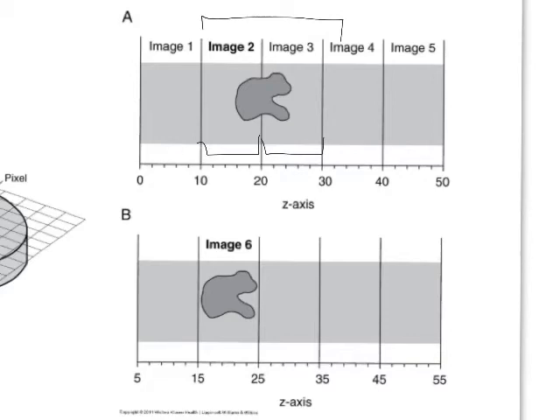This is a significant problem in dosimetry. This is kind of the state of the art. So what we're interested in is how can we get the squirrel in the voxel, right? To where we have a Hounsfield unit that's indicative of the whole squirrel. The big thing that we can do is as we decrease slice thickness, as we make tinier and tinier cuts, we will decrease volume averaging.